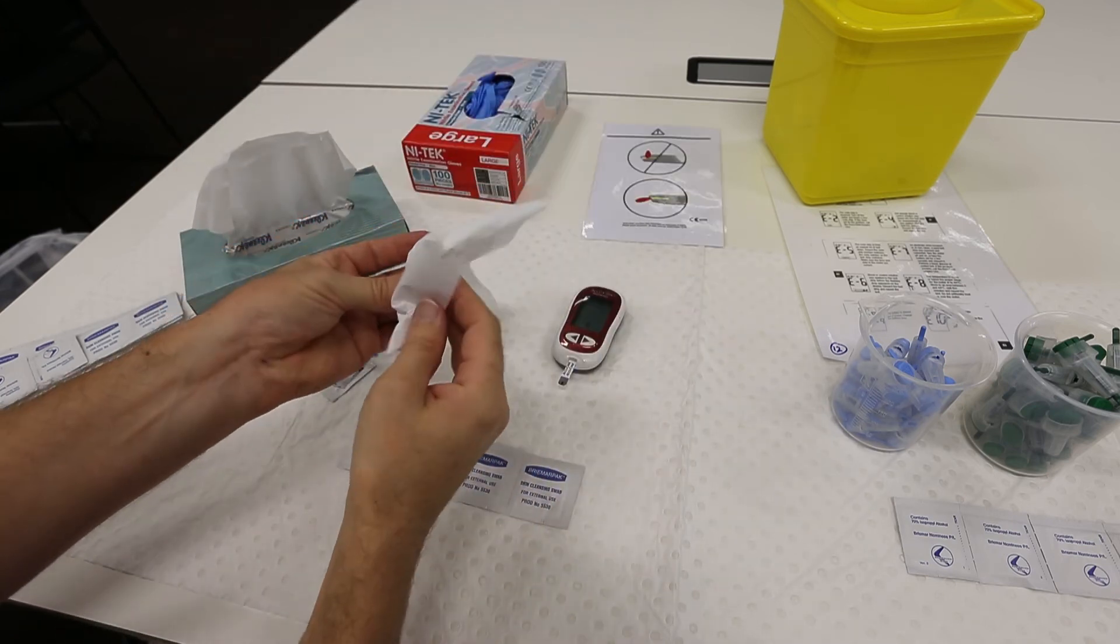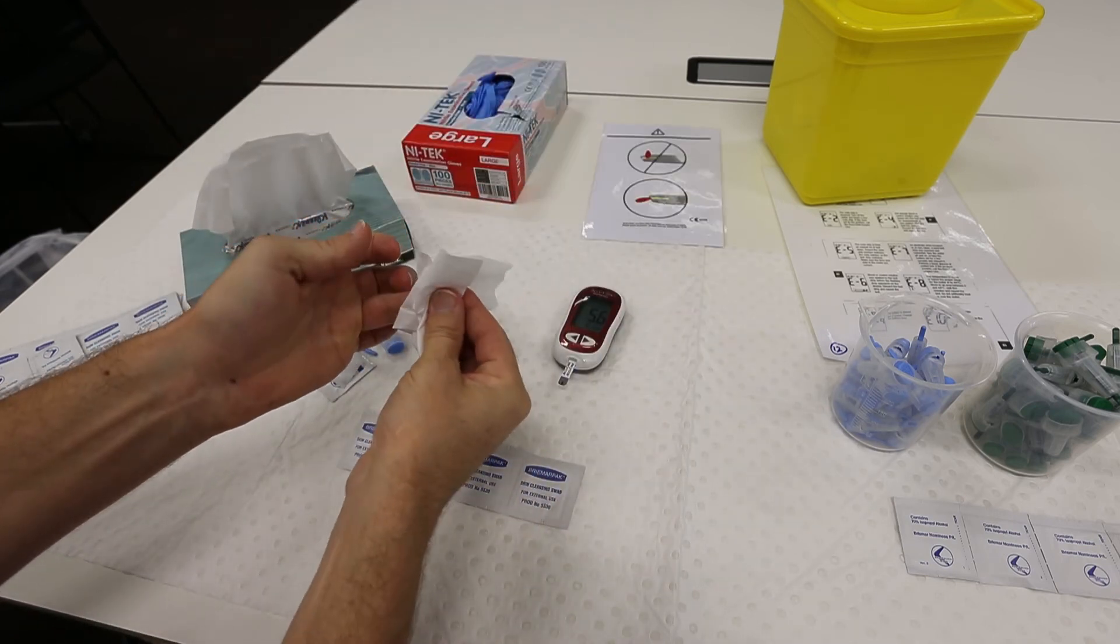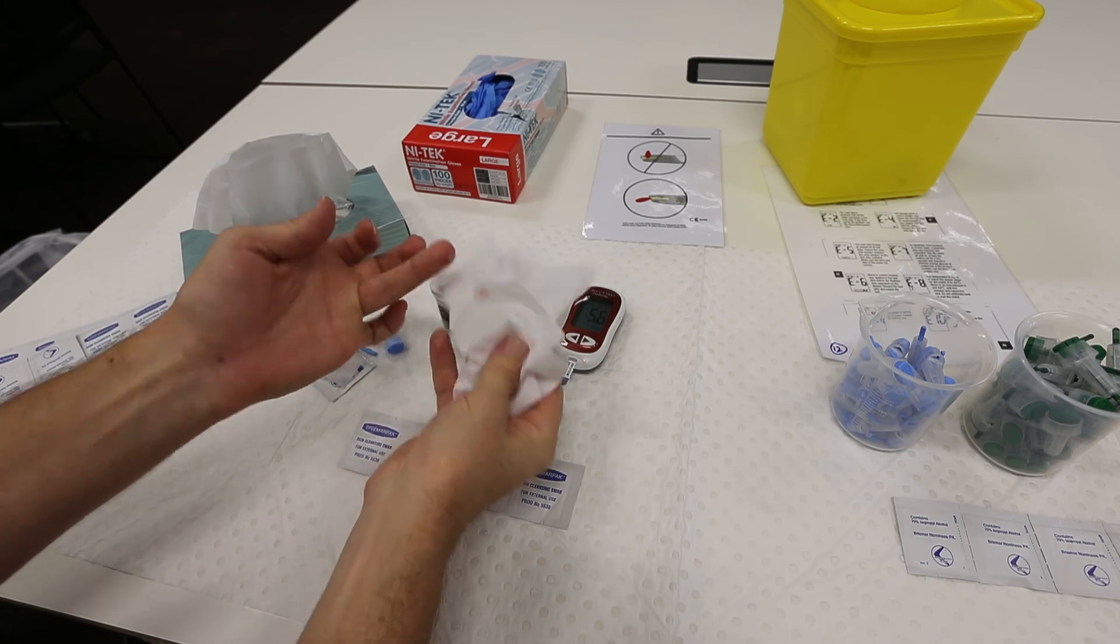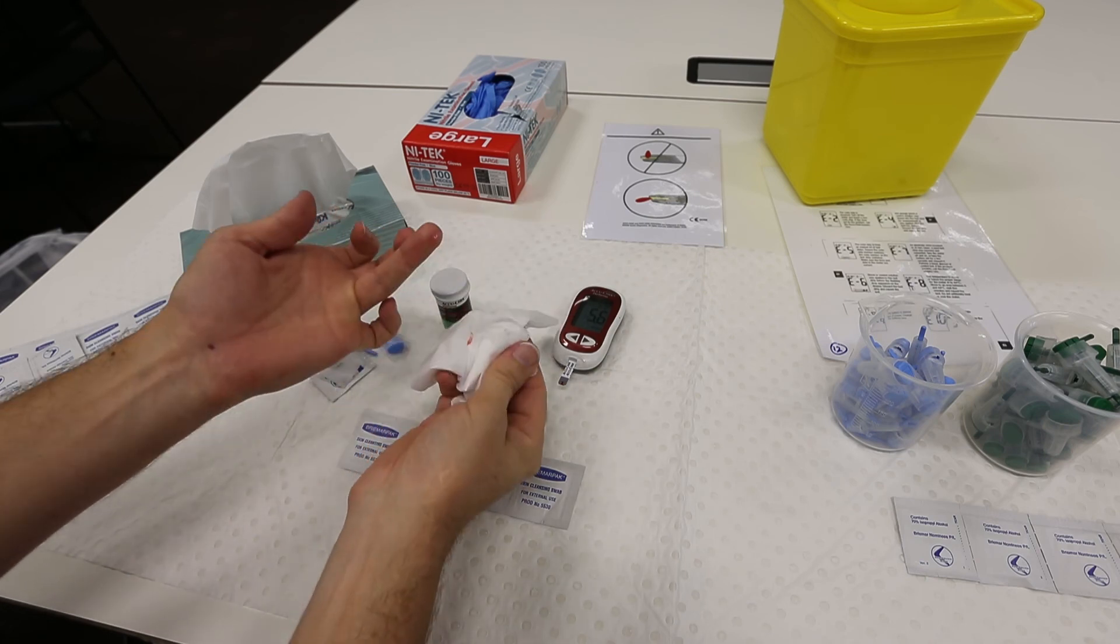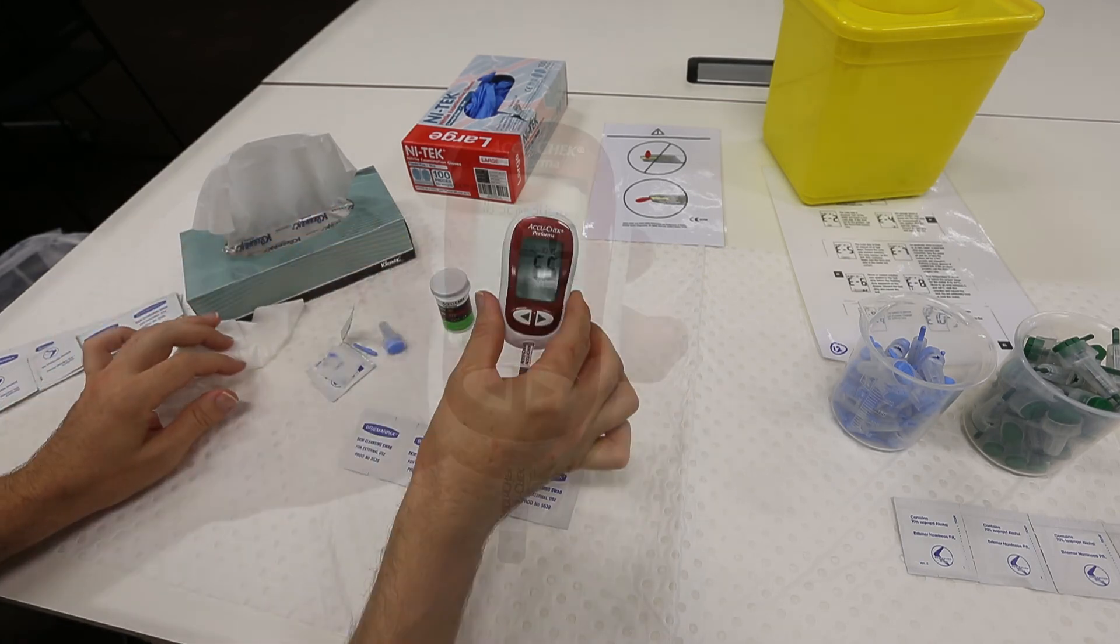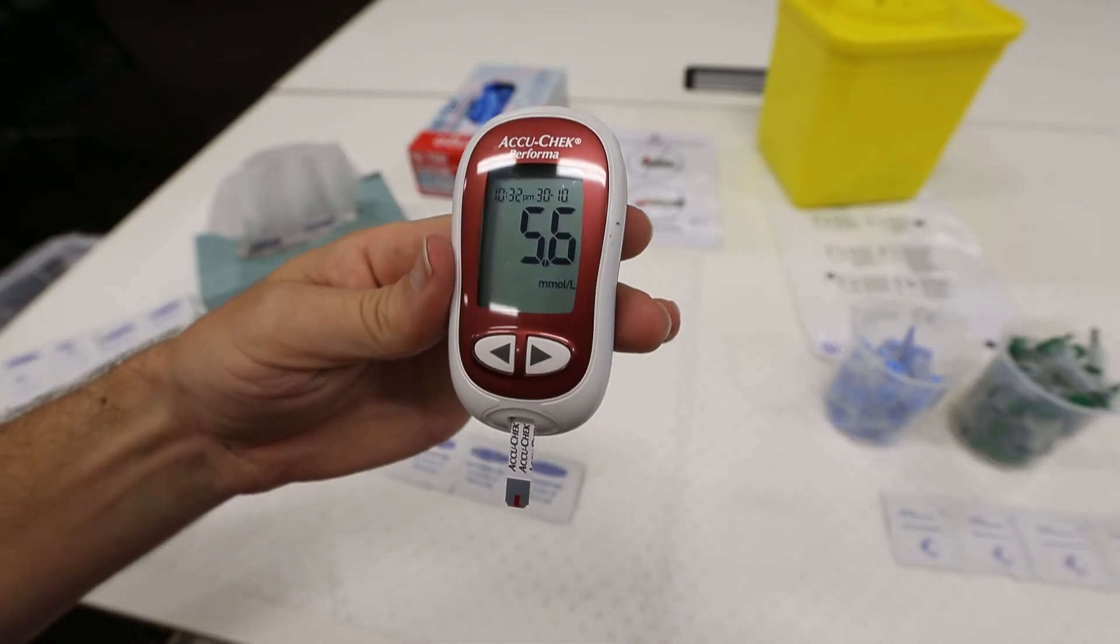Once that is done, place the glucose test meter onto the table and take a tissue and dab the remaining blood from your finger. The glucose concentration in millimoles per liter should now be displayed on the screen of your test unit.